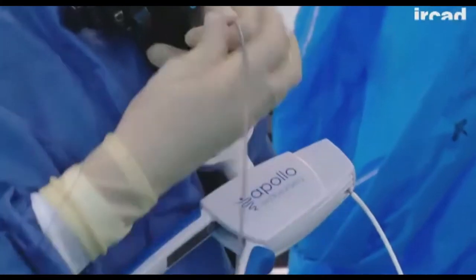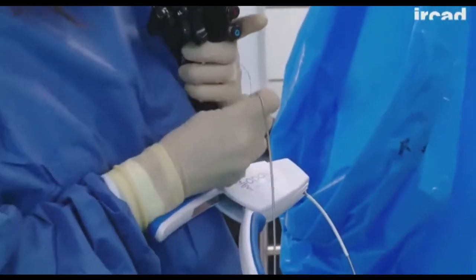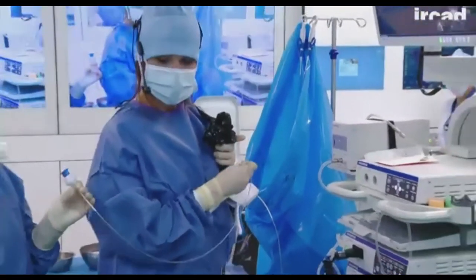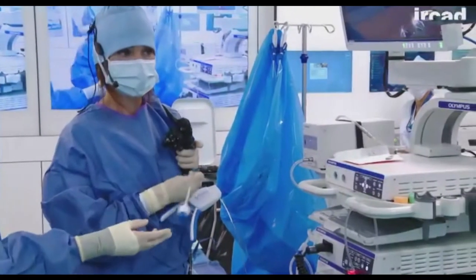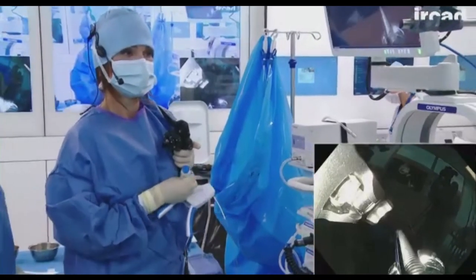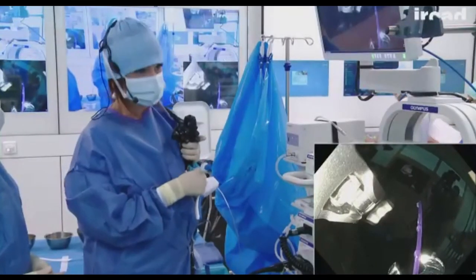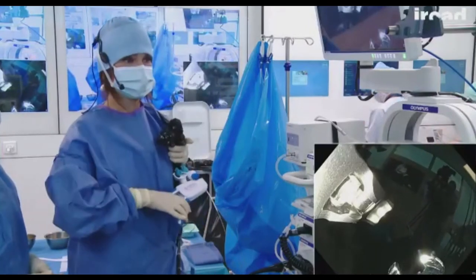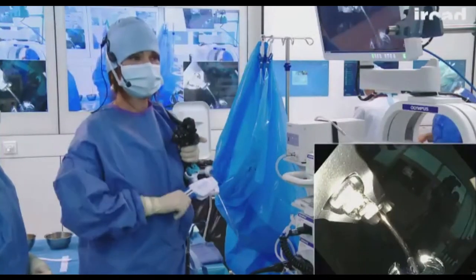I'm going to open up my handle and start the introduction. We placed the sutures in water. This is a hydrophilic filament. So if you put it in water, it will slide much more nicely into the channel. But what we like to do is have a little bit of slack, maybe a little bit too much, like this, just to smoothen the manipulation. I'm gonna close and just check that everything is working fine.